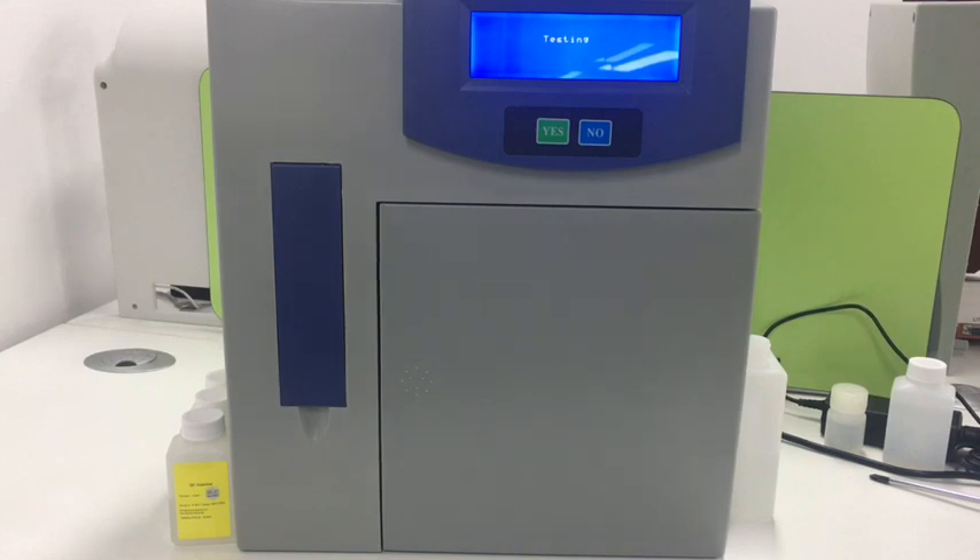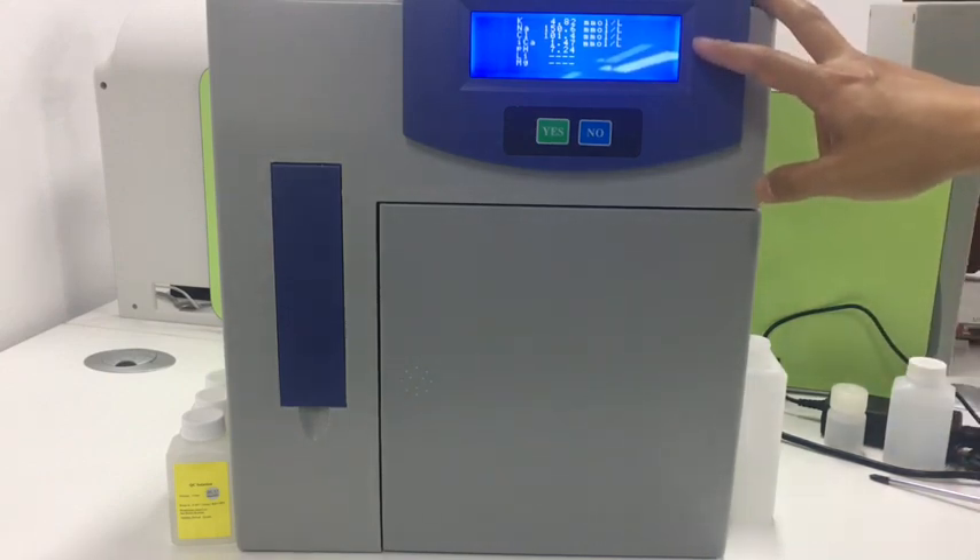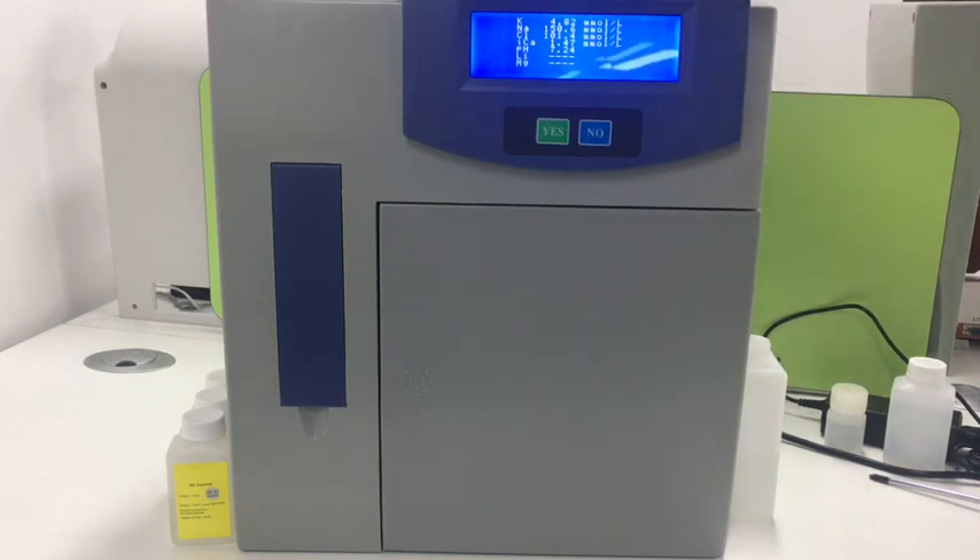Wait for a while and it will show you the result. During sample absorption, we need to avoid absorbing blood cells into the pipe, as it will block the pipeline — so only the serum. Now it shows the result on the screen and also prints it out on paper.